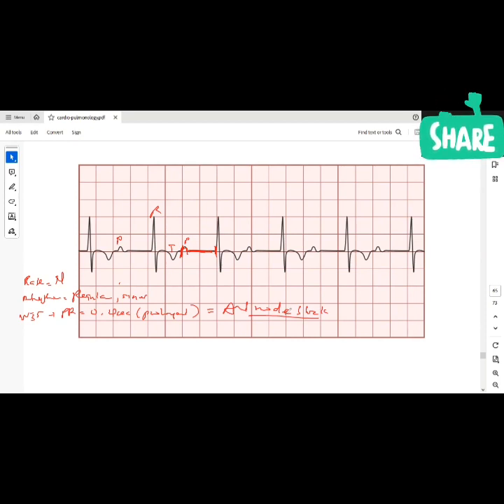So far, so good? Yes. So what do we just enter now, stylishly? We just enter the realm of what? AV blocks, which are one of the causes of bradyarrhythmias, right? Or abnormal heart rhythm. Excellent.